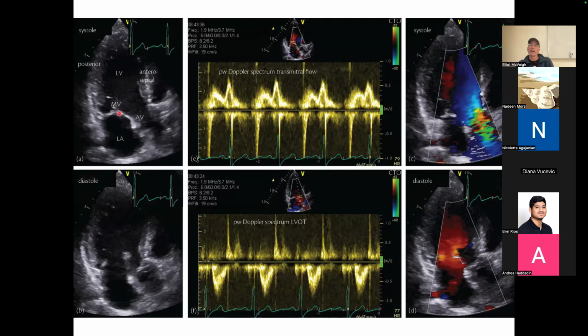We can also make a map for each voxel in this picture. When we sweep across, we'll measure the velocity for each reflector that we're going to map here, and we can color code that velocity. Red to yellow is blood that's flowing towards the transducer. This is the color code of the velocity here. So red means the velocity is coming at the transducer. Blue to green this way means it's going away from the transducer.